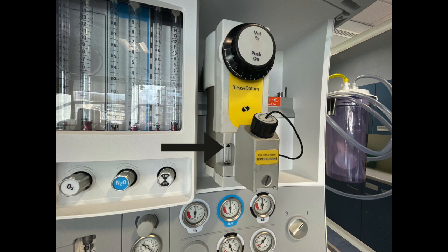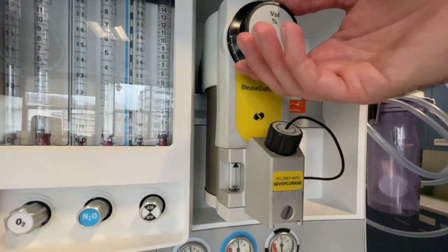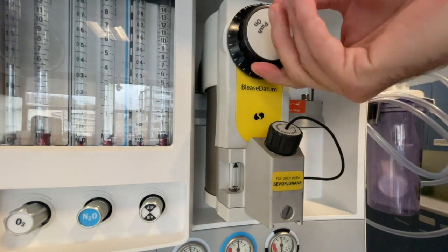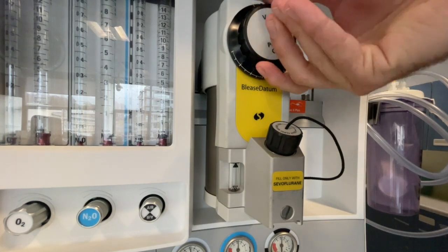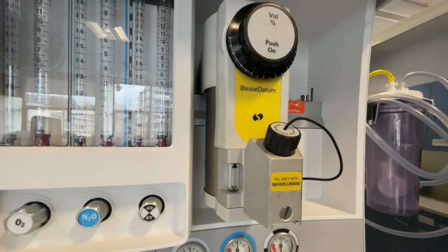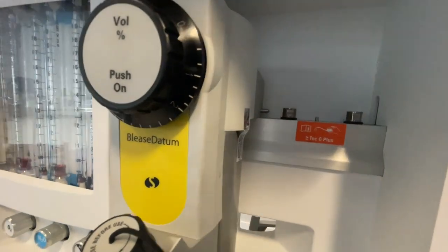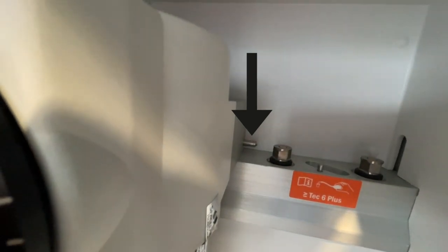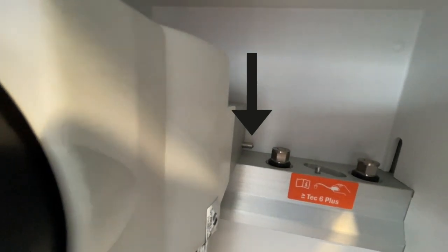First check if the vaporizer has a sufficient amount of volatile agent and top up if required. Check the function of each of the vaporizers and ensure that they are seated correctly on the back bar. You should not be able to turn on two vaporizers at the same time. This style of vaporizer uses two interlocking pins that extend when the vaporizer is turned on, which depresses the neighbouring pin and stops it from being able to be engaged.